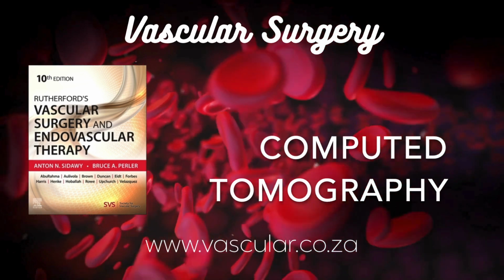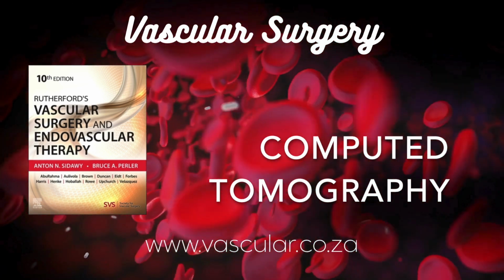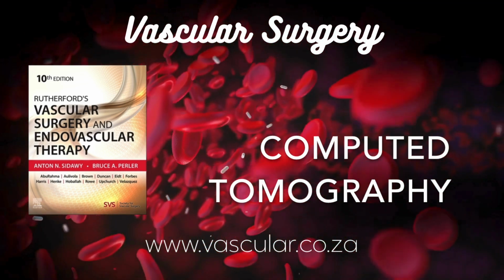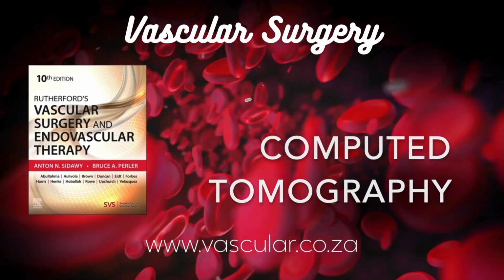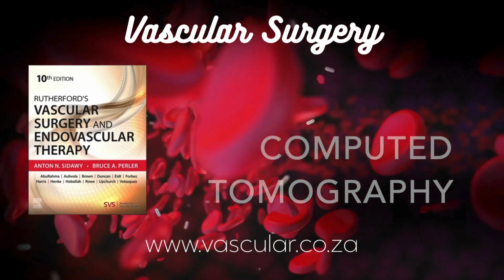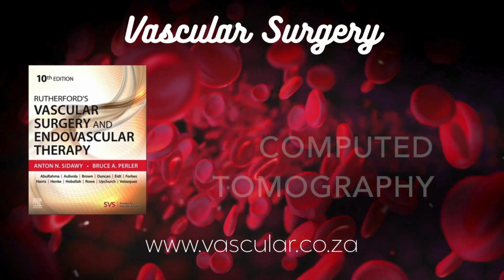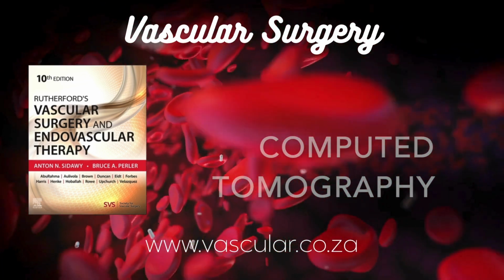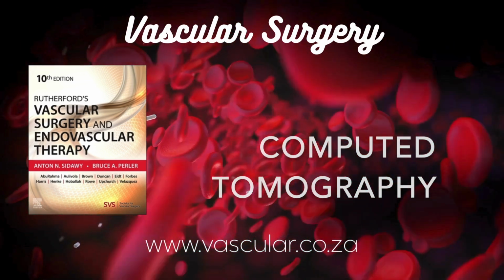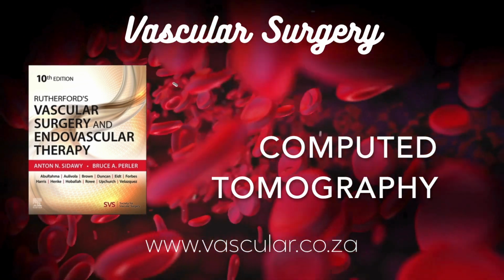Two main ways. Retrospective gating means you scan continuously throughout the heart cycle while recording the ECG. Then, afterwards, the computer sorts the data and reconstructs images only from specific phases of the cycle, usually diastole, when the heart is most still. Advantage, disadvantage? The advantage is you have data from the whole cycle, if needed, good for looking at heart function. The disadvantage is you scan the whole time, so the radiation dose is higher, and since you're only using parts of the data for each phase, the images can be a bit noisier. It's often used for coronary artery imaging.